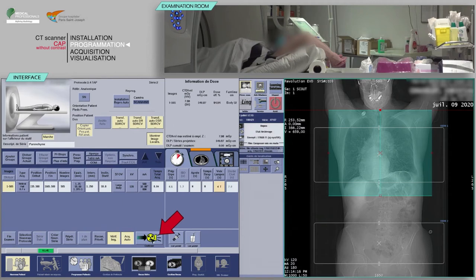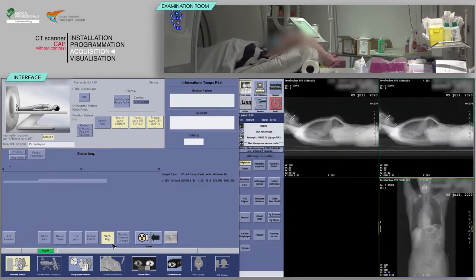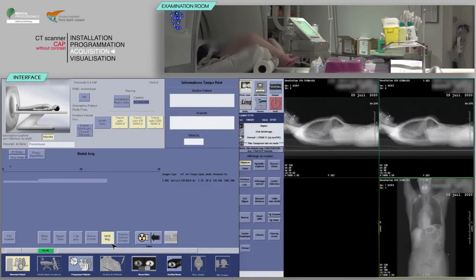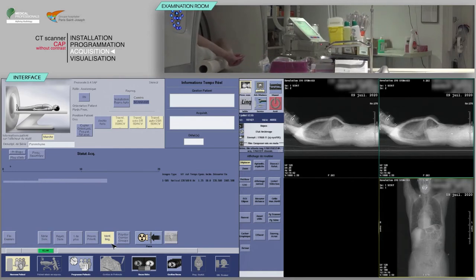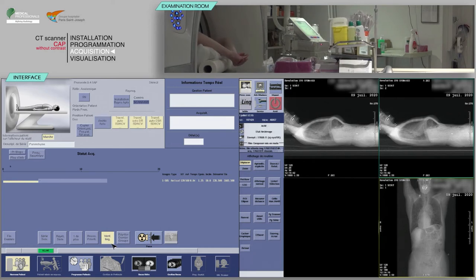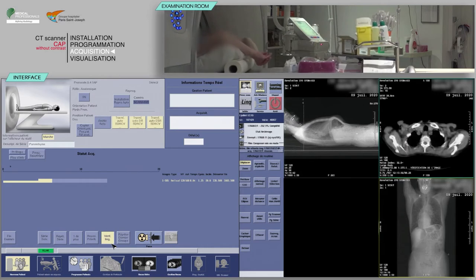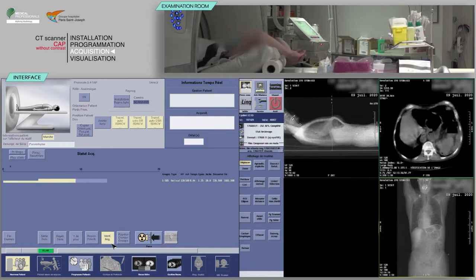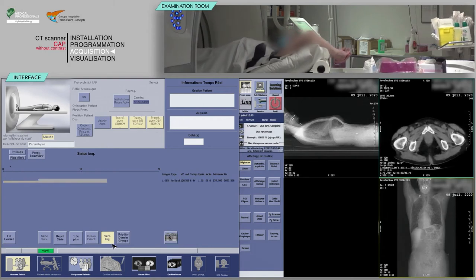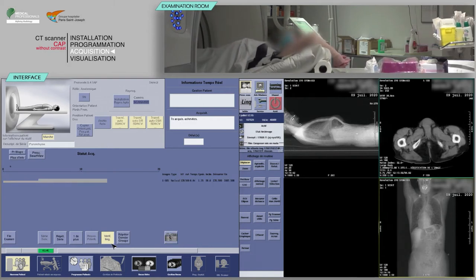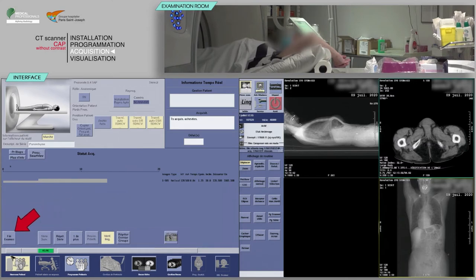Click on Confirm. Using the keyboard, move the table and proceed to acquisition when the buttons flash. Verify the absence of patient motion on the acquisition and that all pertinent anatomy has been covered.